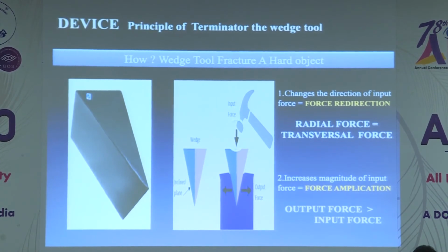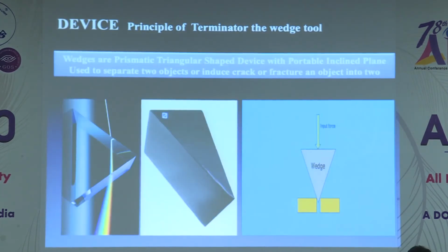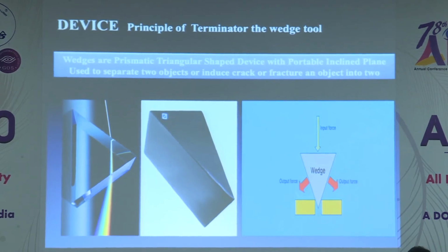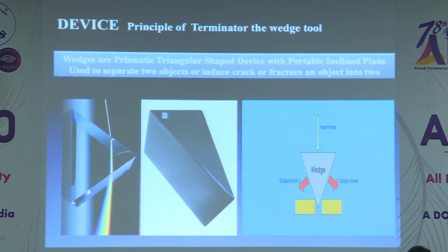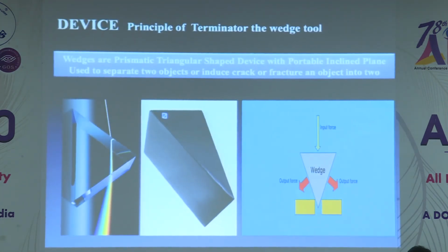So you can see here in this small video how it works. See this video, you can see the animation. This is how it cracks. When this wedge enters into the hard object, it makes a fracture force, that is a transversal fracture force, and that is why the hard objects crack without cutting. You are not trying to cut it, you are just trying to fracture the hard nucleus. A nucleus fractures so easily with a very limited force, because the force amplification is also there.